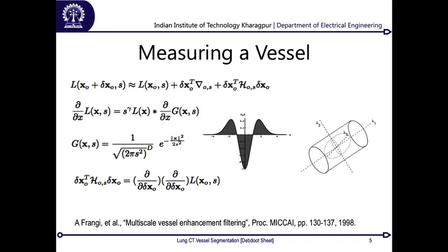Along with that, I have del del z of del del z, which would make it del 2 del z2, right. If I am taking all of them together, that is a matrix which is called a Hessian matrix. In a 2D case you just have a 2 cross 2 operator matrix. In a 3D case, you will have a 3 by 3 operator matrix coming down over here.